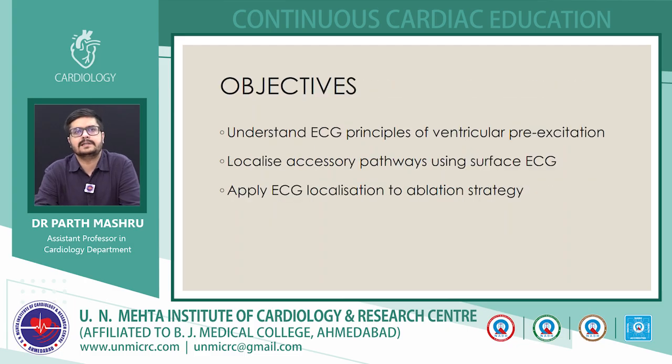So the objectives of today's class: firstly, understand the ECG principles of ventricular pre-excitation. We have heard a lot about pre-excitation in the ECG, but what exactly is pre-excitation? What is exciting prematurely, and how is it happening when there is an accessory pathway? That concept is very important and vital to localize the accessory pathway using the surface ECG. And once you localize that accessory pathway through the ECG, then you can decipher the strategies for ablation and further management.